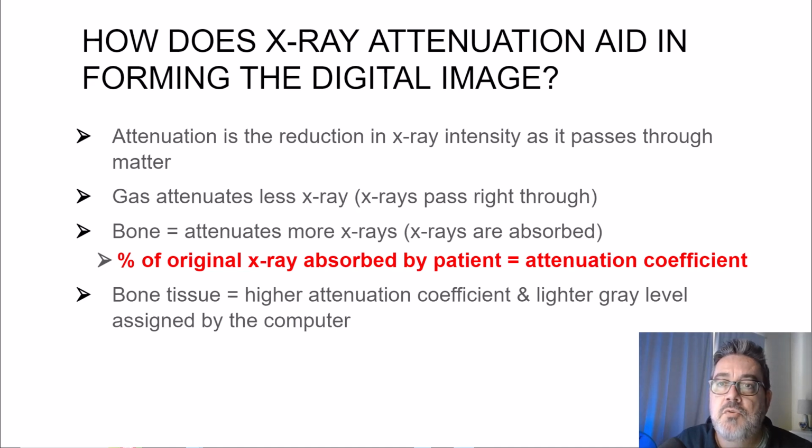Let's just say two people walk into your department for lumbar spine x-rays. A 35-year-old male football player who tweaked his back at last night's game. And the other person is a 90-year-old female who felt a twinge when she leaned down to pour food in her cat's bowl. Sure, you can use the preset L-spine technique for both of those patients.